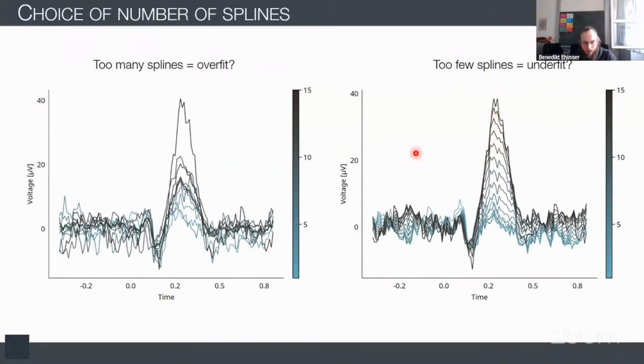The really big and, unfortunately, to some degree unsolved question is how to choose this number of splines. From our experience with our models, if you stay below 10, and I typically just take 5 or 4 splines, that seems to be right. I'd rather underfit a little bit than overfit a little bit.